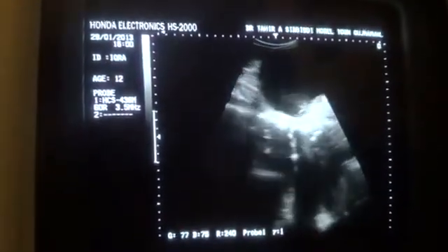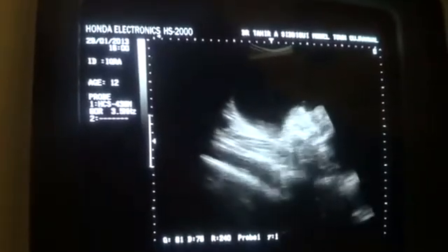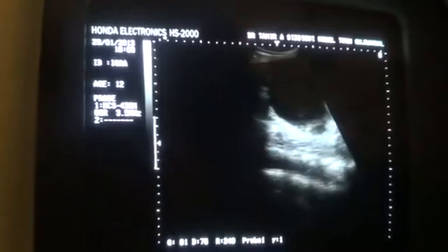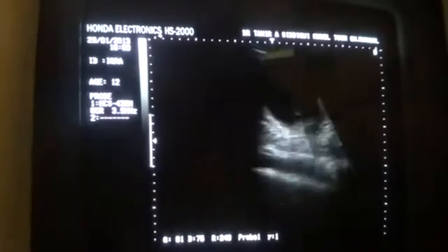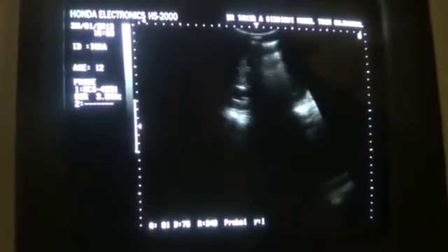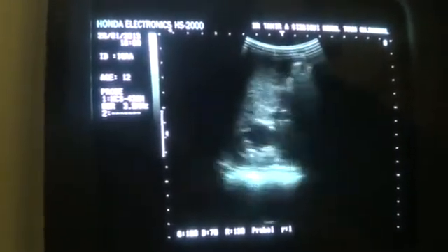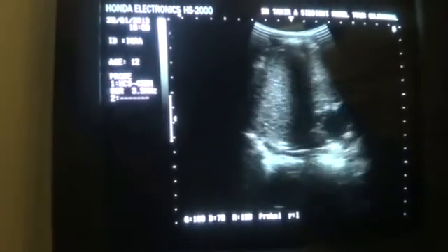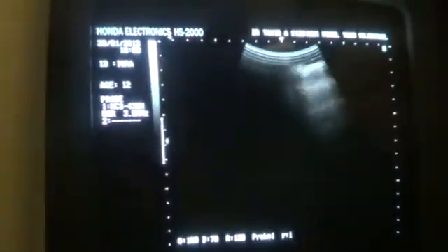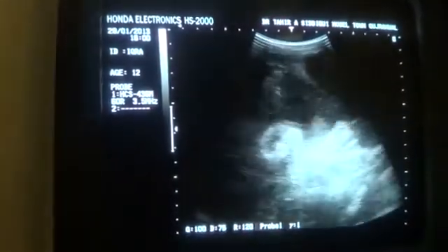and even you may be able to see, maybe the fluid is more than 3 liters, so minimum 3 liters I will consider is the fluid present. This is the aorta, this is the cystic area. And now why were we seeing this hydronephrosis on the right side? Because the pressure of the cyst on the right ureter is much more as compared to the pressure on the left side. So that's the reason for this hydronephrosis in the right kidney. This is because of the pressure effect or the mass effect from this large cystic area on the right ureter, though it's seen on both sides.